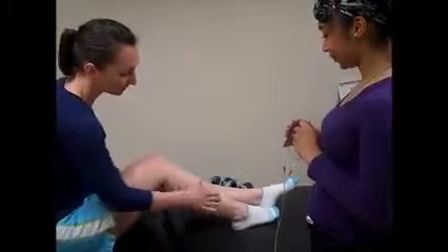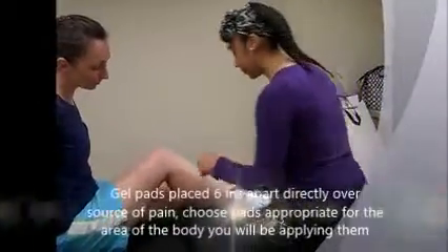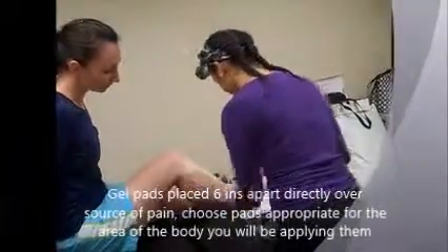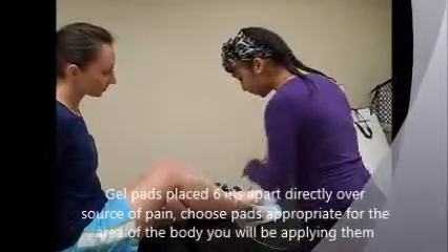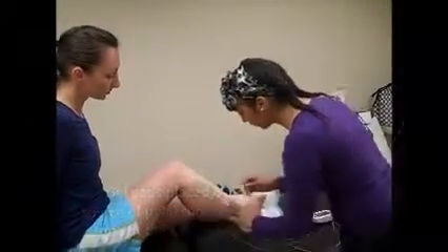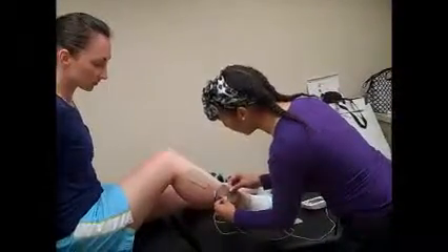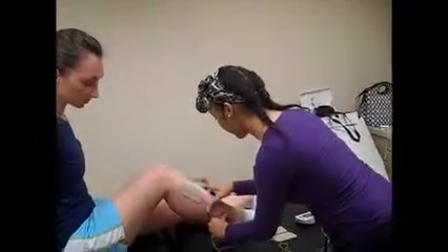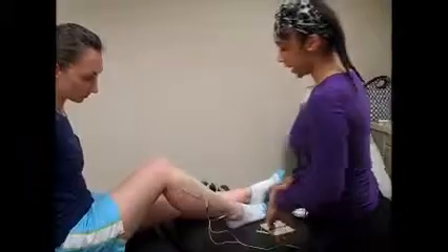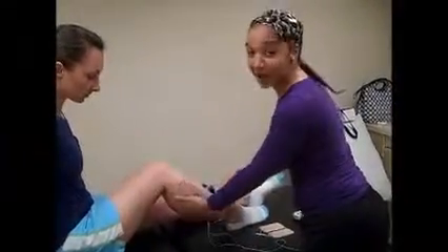So Sarah, where are you experiencing pain today? It's kind of here in my lower leg. Okay, so we're going to go ahead and place it here and we're going to place the pads six inches apart. These are really big pads — you're going to use pads that are appropriate for the size of the area you're looking at, so we would probably go for pads half this size, but for this purpose just use your imagination.